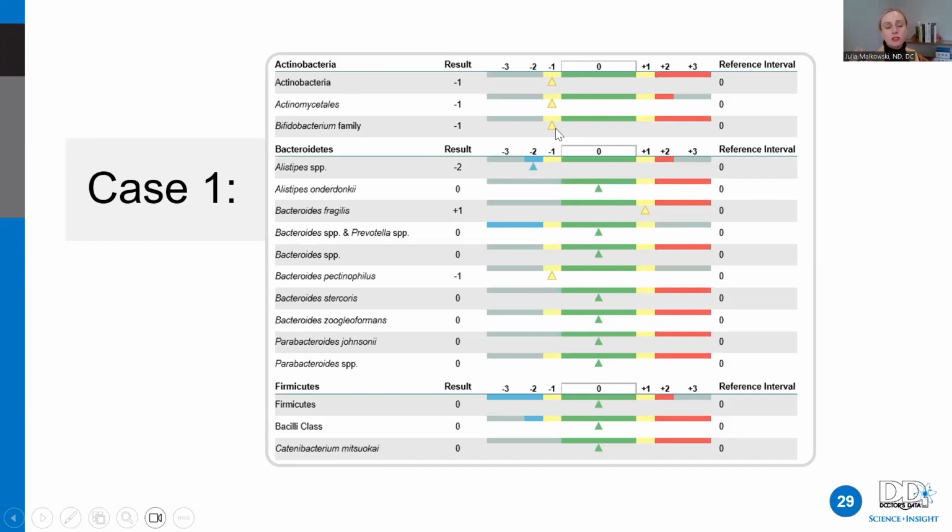So the patient needs more vegetables, soluble fiber, but with this bifidobacterium being low, they're going to be at risk of metabolism issues, vitamin metabolism issues. We want to help this patient here before this gets worse, okay? So these are the detailed findings that you will see on pages 2, 3, and 4 of the report.